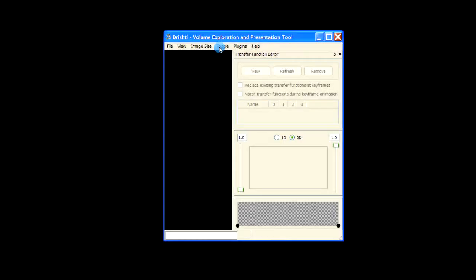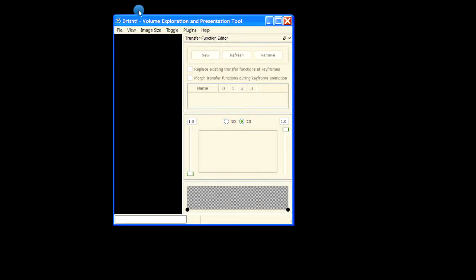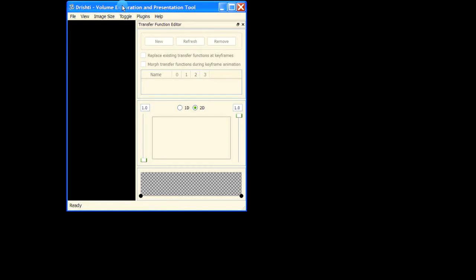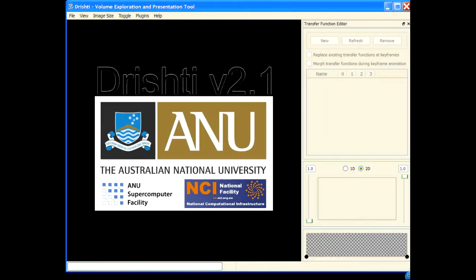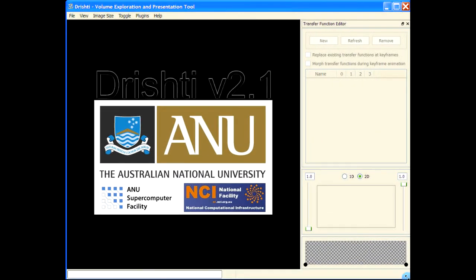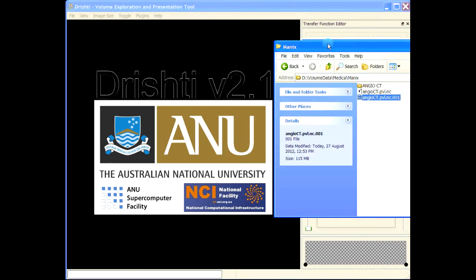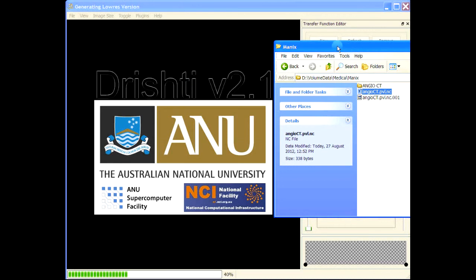Let me kill that off, let me turn that off, and let us start Drishti Render. And we will load this pvl.nc file and render the data. So I'm dragging and dropping angio_ct.pvl.nc.